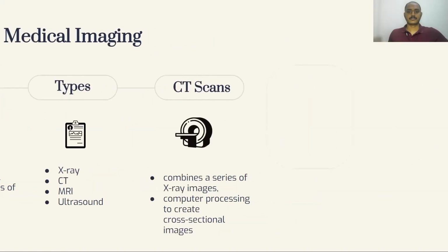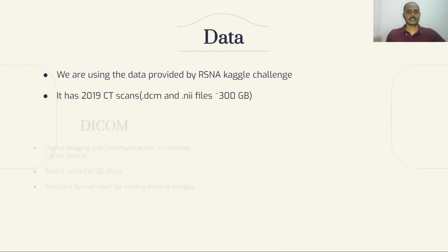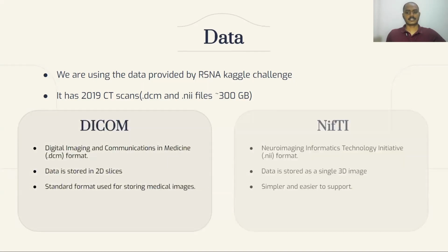Thank you, Aayush. So to give you an overview of our approach, let's start with the data. Our data consists of 2019 CT scans obtained from the Kaggle RSNA challenge. Data from the CT scans were extracted in 2 formats. The first is a DICOM file and the second as a NIFTI file. These formats can be considered as normal images, just with patient data such as name, age, gender, study details such as the name of the physician, the time of the study, as well as the device details such as the name, manufacturer, and scanner details.